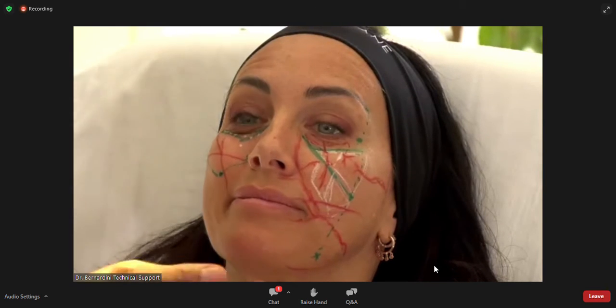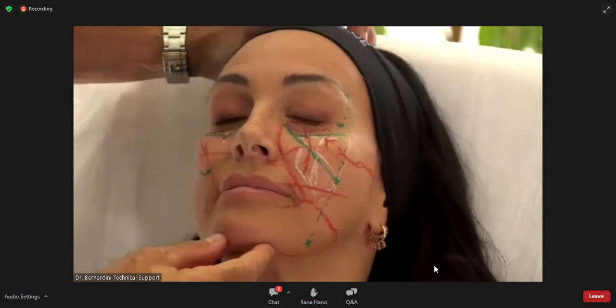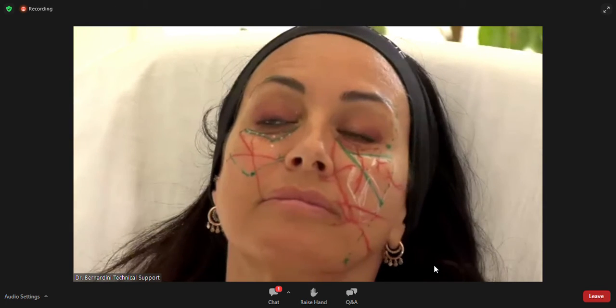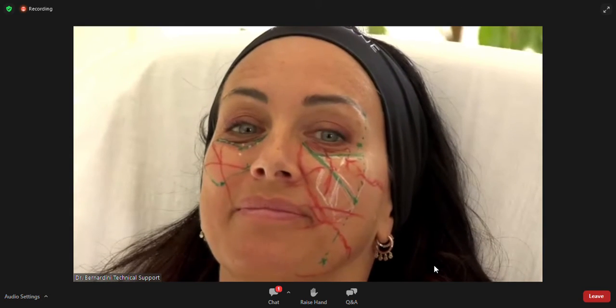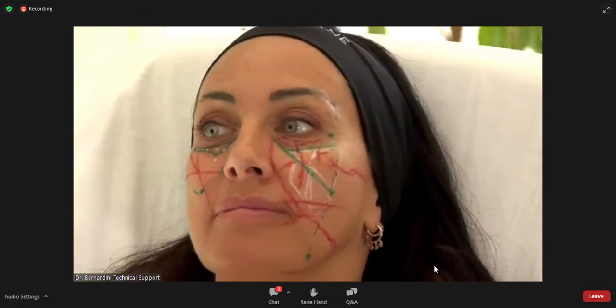So we keep the anatomy intact for the moment. We'll clean up this, we start with this and we move along. Okay, yes. Grazie, open it. Any questions for now? All clear?